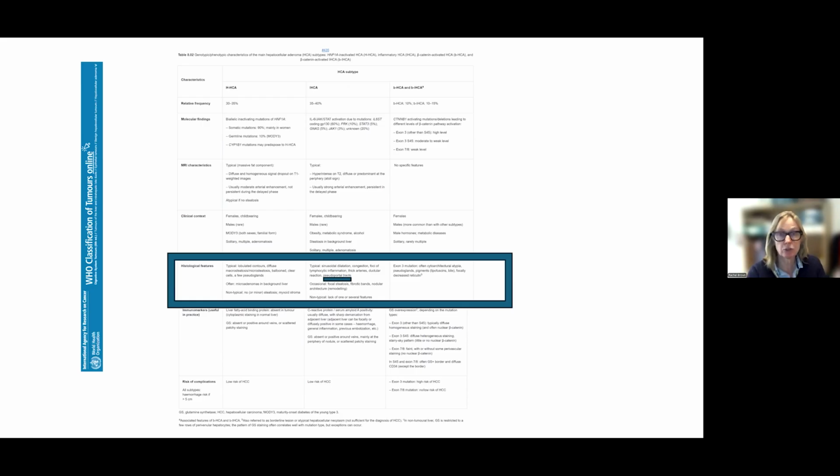So that's quite a nice term, actually. And I think several of those examples I just showed you would, pseudoportal tract is mimicking a portal tract, but it isn't quite right. And it doesn't have a duct next to the artery. You can see steatosis, you can see fibrosis, and you can see some nodularity of architecture. So those would be the typical features for an inflammatory hepatocellular adenoma. The other two major types of adenoma are described here. So the HNF1 alpha inactivated, typically a steatotic lesion, can be multifocal. More on this coming later.